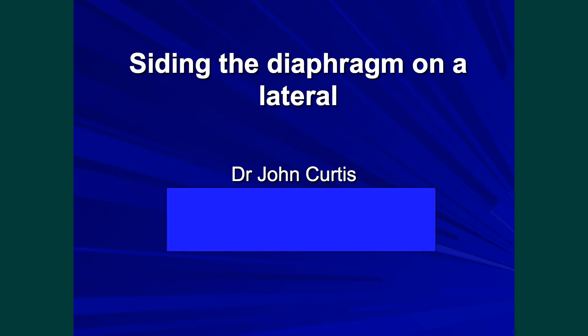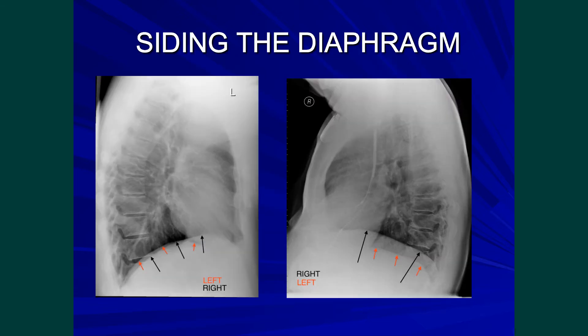At the end of this short talk you will be able to side the diaphragm on a lateral film. On the lateral film the right hemidiaphragm goes from back to front without being interrupted, and in this particular example is projected over the lowermost portion of the heart.